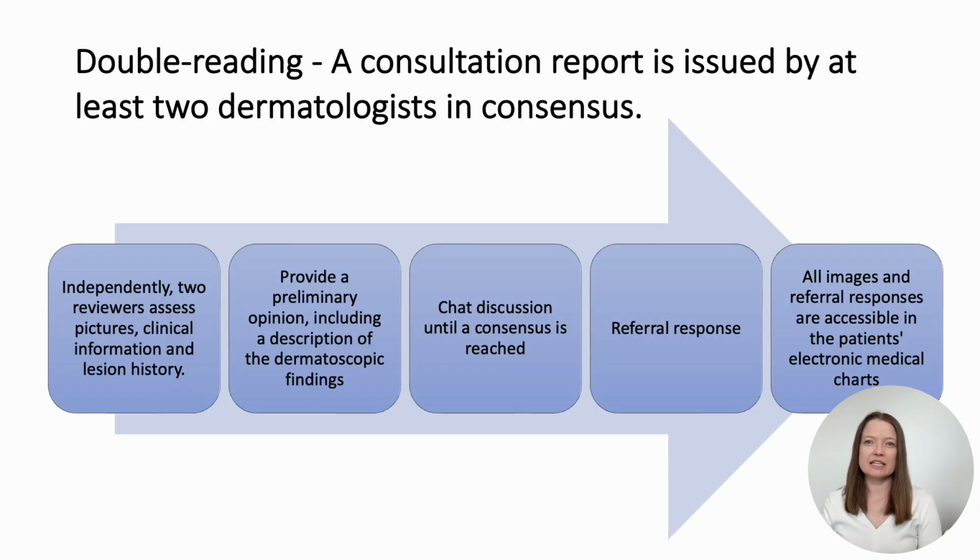Double reading involving the co-assessment of cases is an important aspect in teledermatoscopy. Our experience indicates that the co-assessment of cases plays a central role as a training tool for new reviewers. It has helped us in recruiting additional team members and holds the potential to enhance sensitivity while reducing unnecessary excisions.